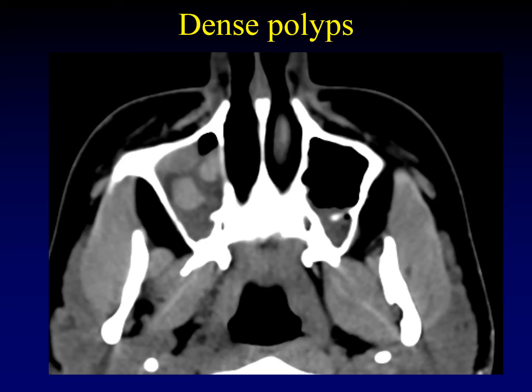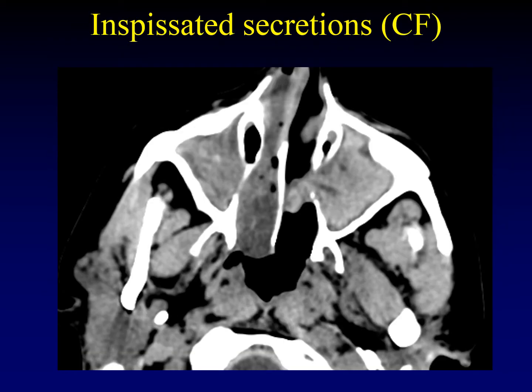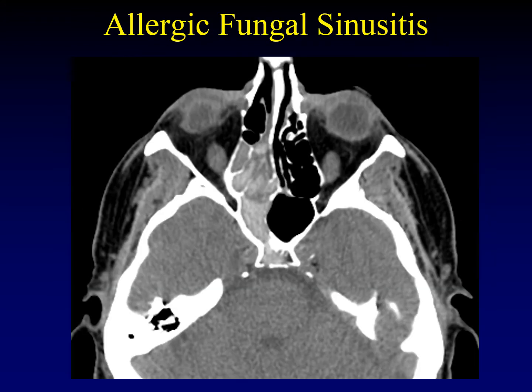Here's an example of radio-dense polyps interspersed with mucosal thickening that is not as dense as the polyps themselves — not all polyps are dense, but some are. This patient with cystic fibrosis can't clear mucus, and these dense secretions don't necessarily mean fungal superinfection, though we are particularly worried about that in patients who have undergone transplant and are immunocompromised. All forms of fungal sinusitis can have radio-dense secretions — this example happens to be allergic fungal sinusitis, but invasive fungal sinusitis and mycetomas can also have increased intrinsic radio-density.